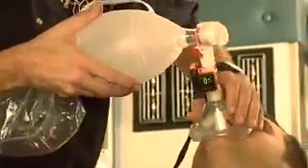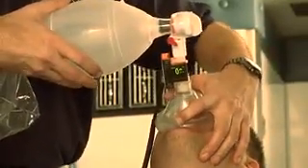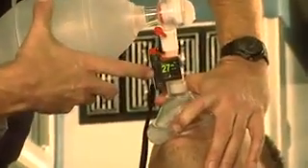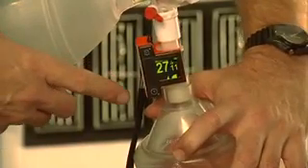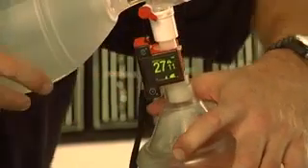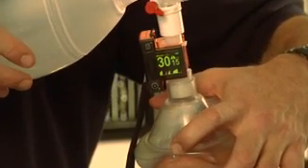So if we connect this and we place the mask on the patient, and the patient's breathing spontaneously as he was, we'll actually see a carbon dioxide level and a respiratory rate on the screen, as well as a miniature waveform on the bottom that allows us to actually watch the breaths that the patient's taking in and out.